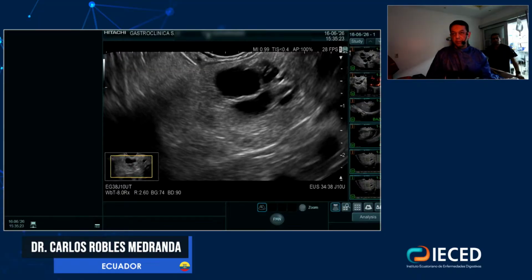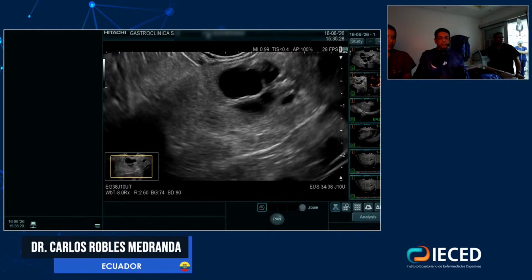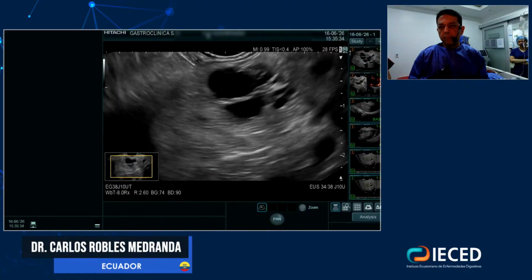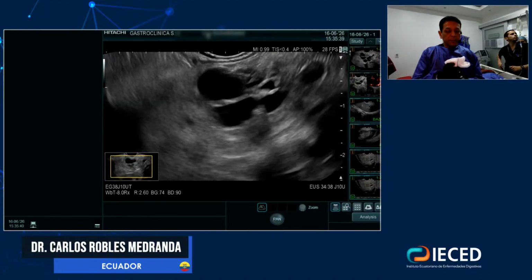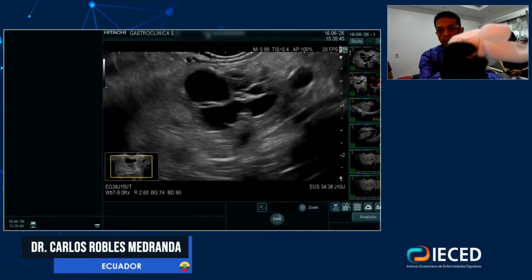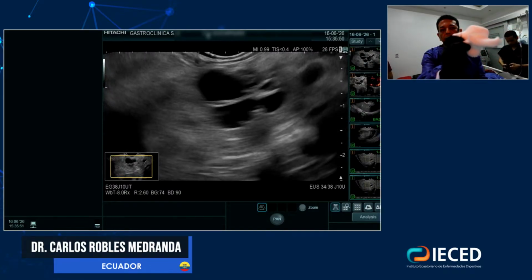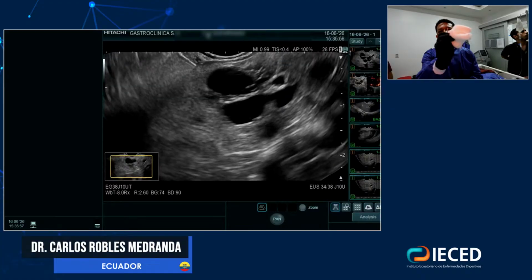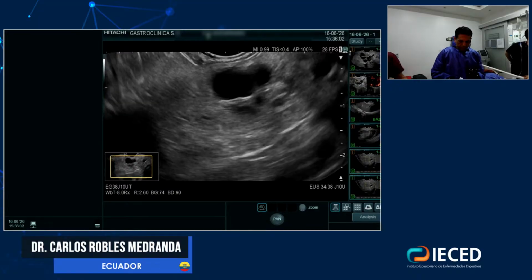So thank you to Asteris, also to my good friend Tony Siracusa. Thank you so much for all your help. So you can see here, aquí está bien. Puedes aproximar la cámara. So you can see here, retrocedo un poquito. So she will put it just until the tip. Un poquito más. Okay, perfect. So now I am perfect. And then I will pass my needle inside.